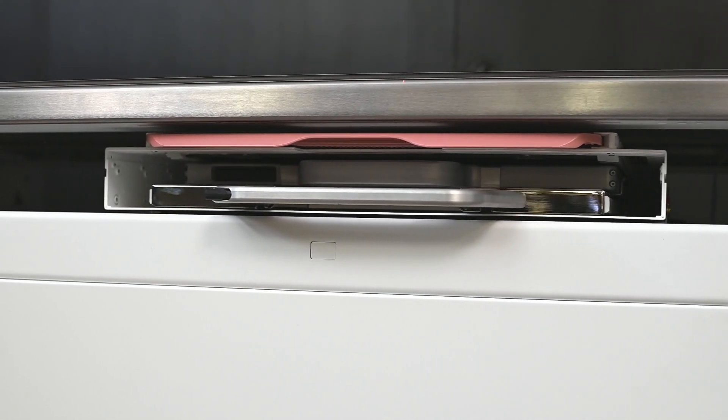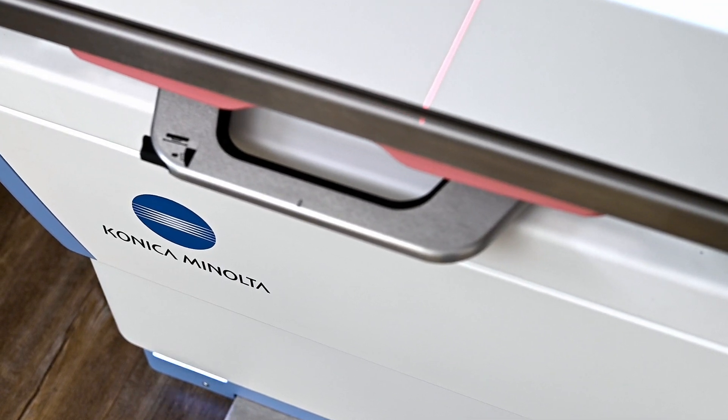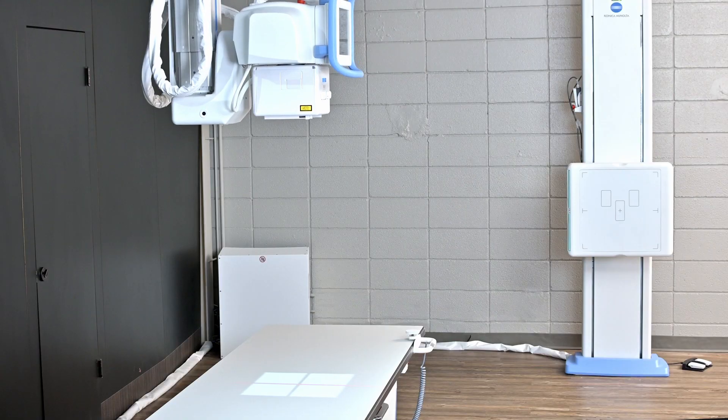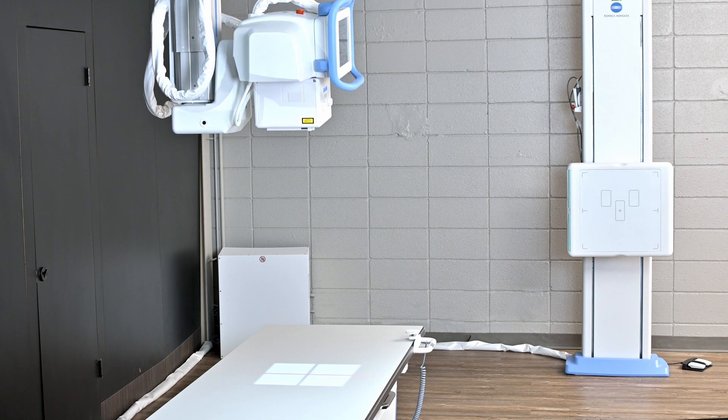Some of the great features of the Flex overhead tube crane also include the ability to do table stitching. Pediatric stitching up to three images can be stitched on the table at a specific SID, allowing us to manage stitching at all different levels.